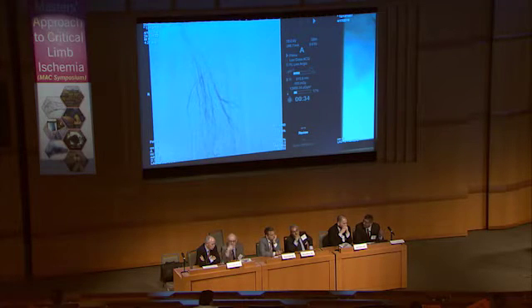This picture is very revealing, and I think that this actually does tell me that there is a good chance that we could be successful, and the amount of flow, at least in my view, from the profunda is much less now. And what does the panel feel? Alex, start with you and give a quick, short comment of how do you assess this angiogram?